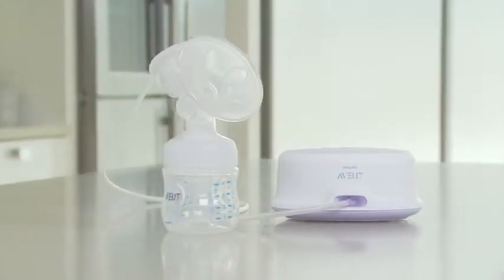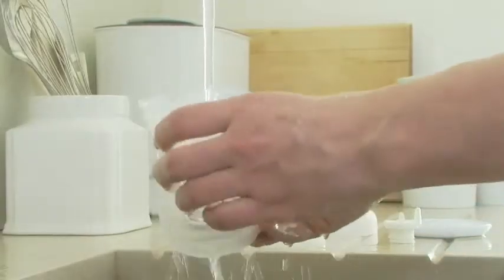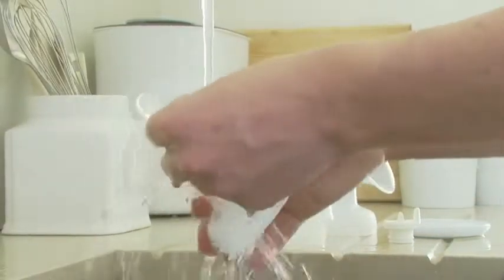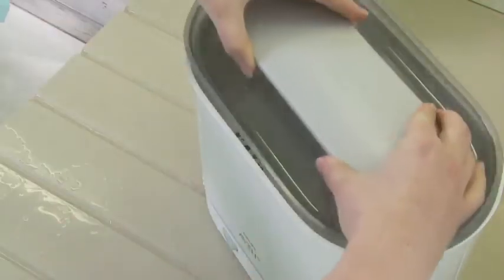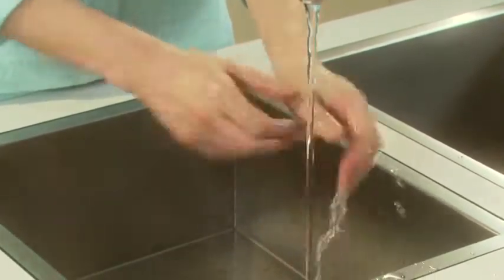Philips Avent Comfort electric breast pumps are simple and easy to assemble. Before you start, make sure you wash, rinse and sterilise the non-electrical parts, and wash your hands thoroughly before you handle the cleaned parts.